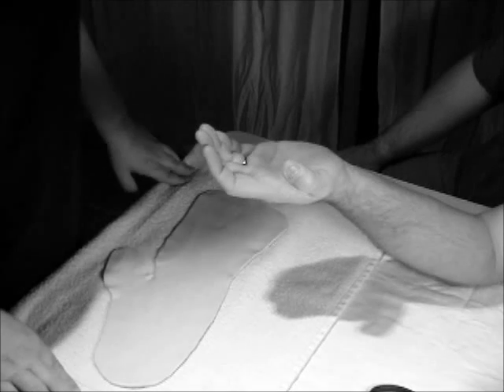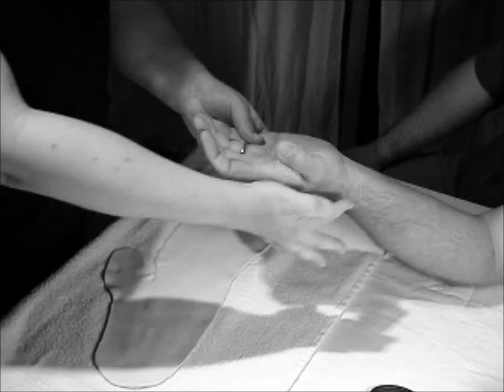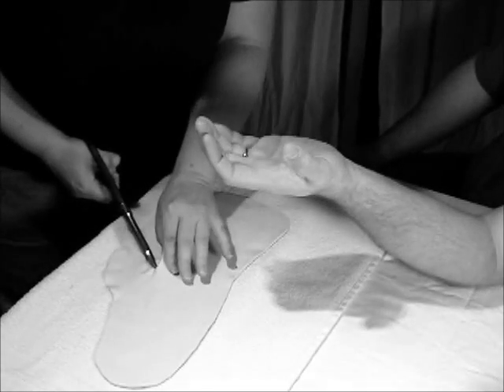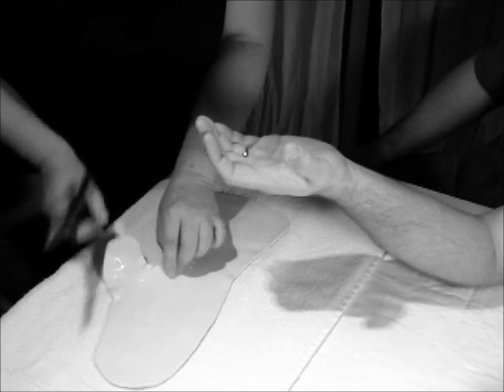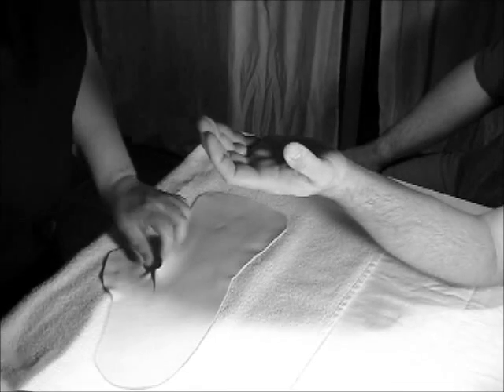Okay, we're going to start with the resting hand splint, and you want your patient to be in a relaxed position. The wrist is in about 20 degrees of extension. And I already kind of pre-cut this. The pre-cuts that they sent ran a little bit large, so I'm making this just a little bit smaller for Scott.